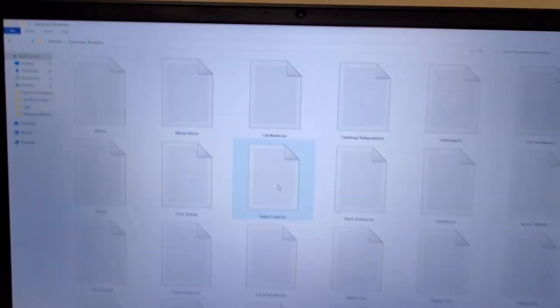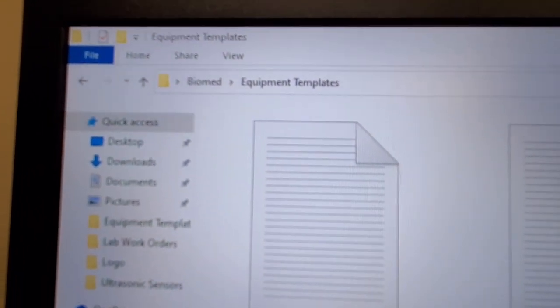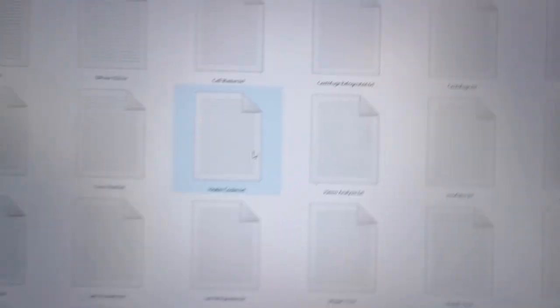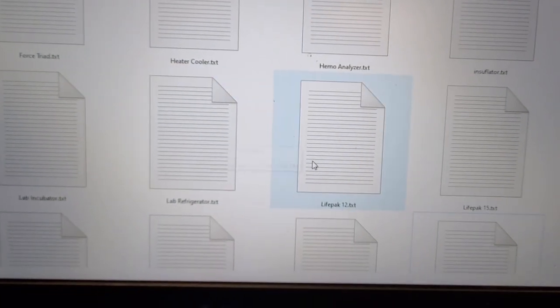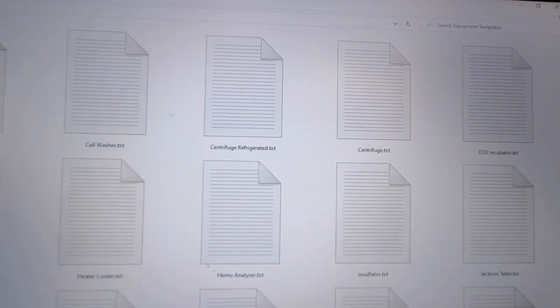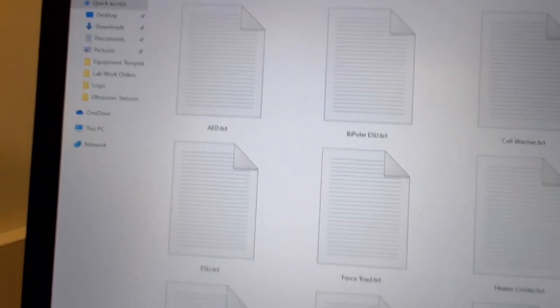Here is one of the folders on my laptop. You can see that I have a Biomed directory and then I have equipment templates under that, and I have all of these right here. You can see we've got heater cooler, lab refrigerator, LifePak 12, LifePak 15, insufflator, Jackson table, centrifuge, CO2 incubator, refrigerator centrifuge, bipolar ESU, and AED.